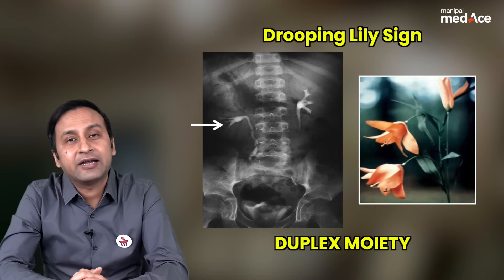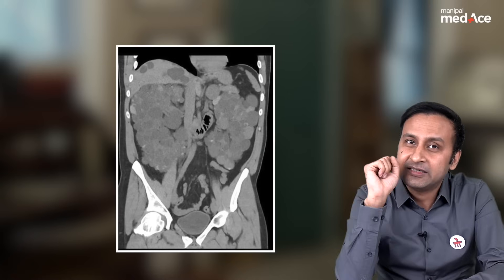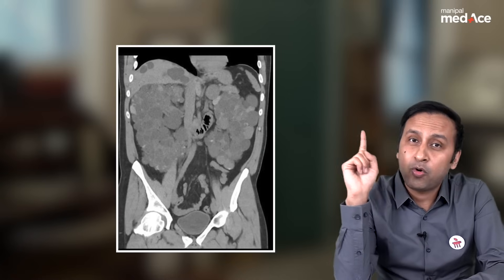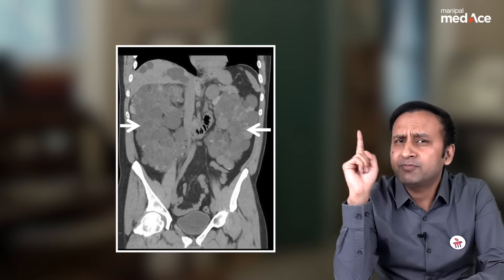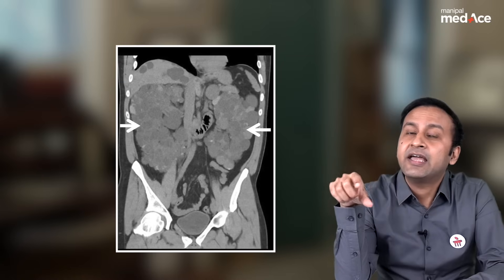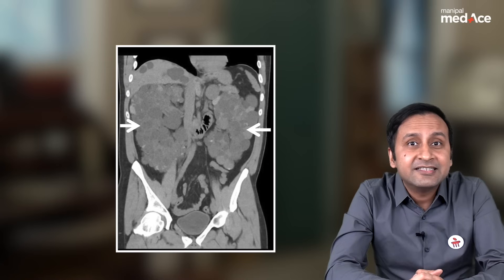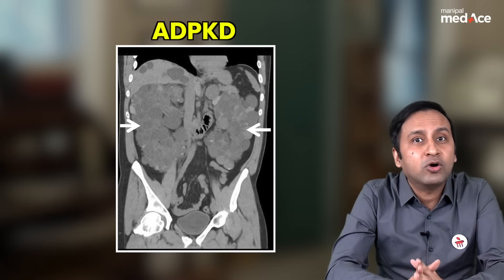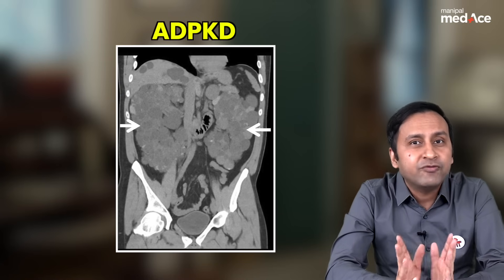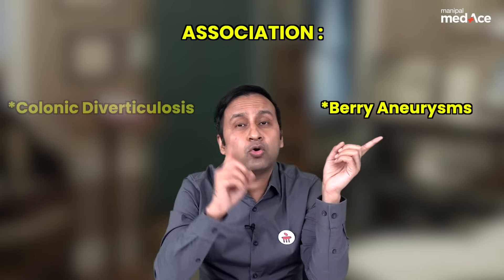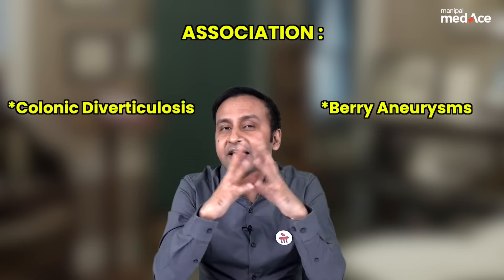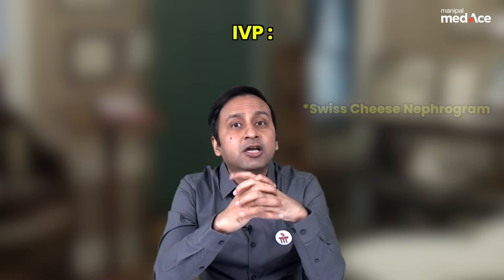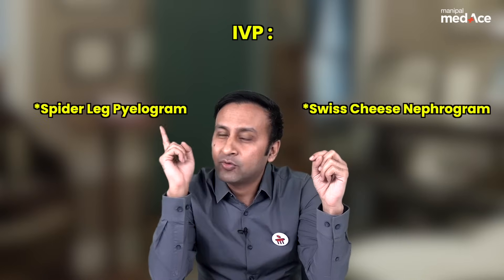On this CT image, both kidneys are enlarged and there are multiple cysts embedded within the renal parenchyma. This is a classical example of autosomal dominant polycystic kidney disease (ADPKD). ADPKD is associated with berry aneurysms and colonic diverticulosis. The important IVP signs seen with ADPKD are the Swiss cheese nephrogram and spider-like pyelogram.